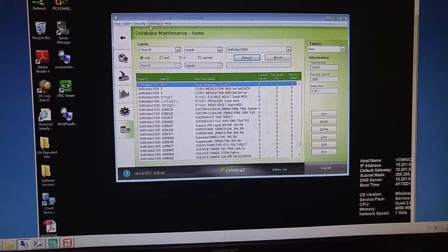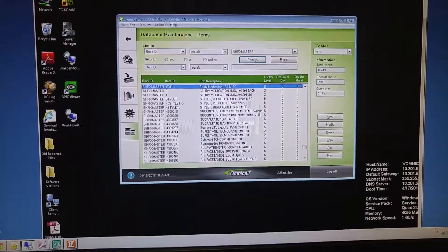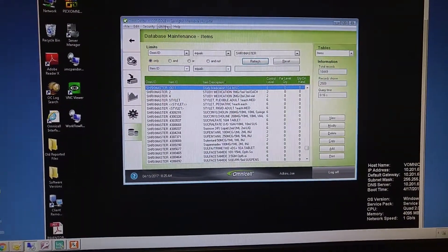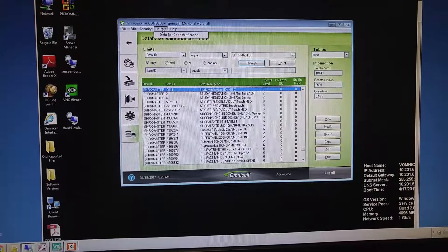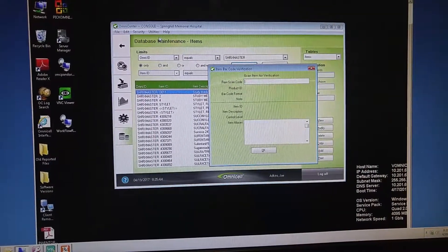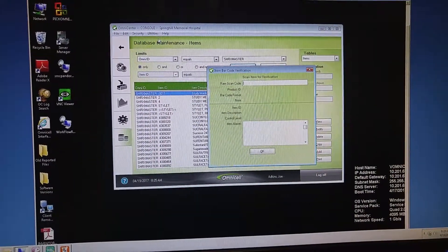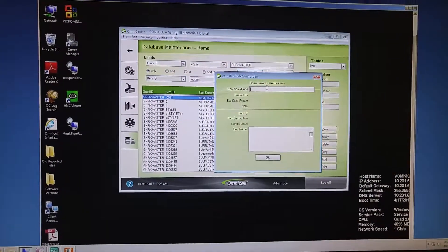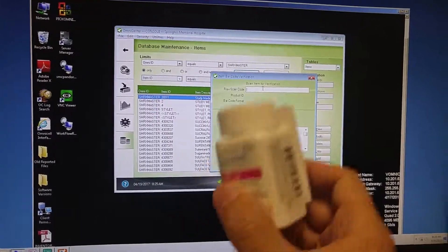So before you even log on, up at the top, you click on Utilities, Barcode Verification. Okay, this will allow you to scan any item.